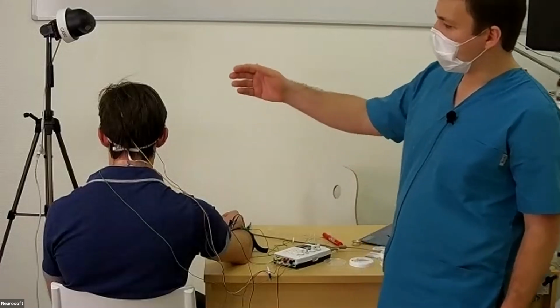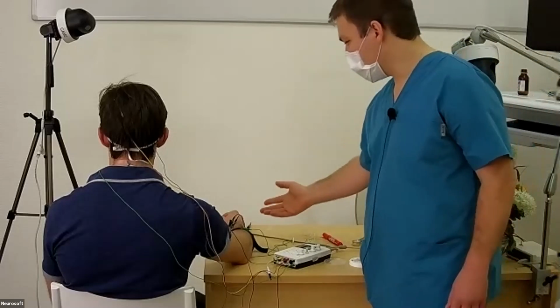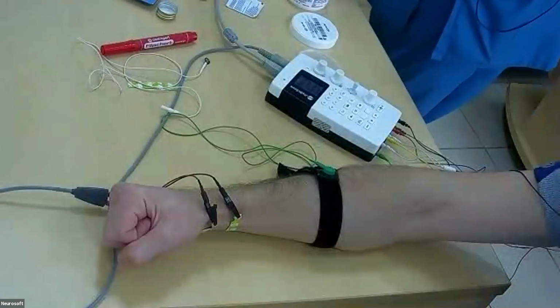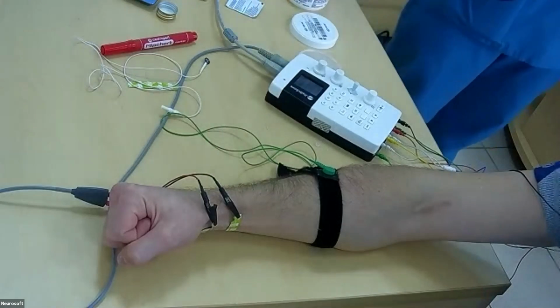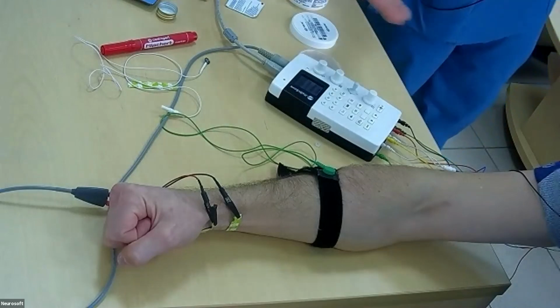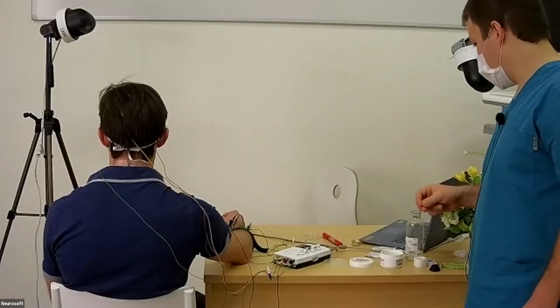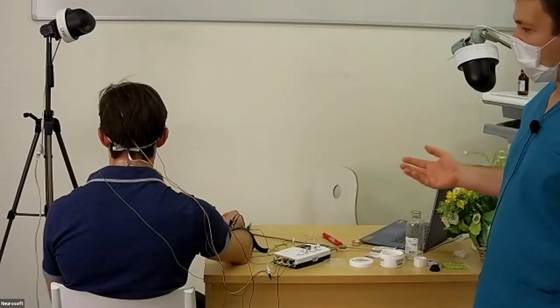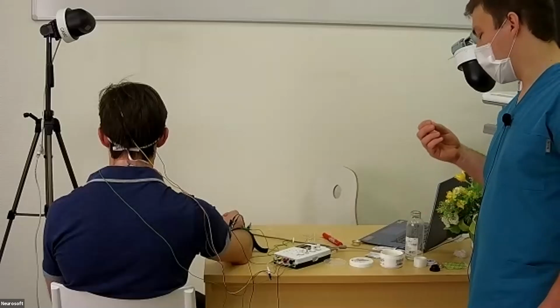We will register responses from these three lines from electrical stimulation, with median nerve stimulation. For registration we usually need to use cup electrodes, because we need very good, very low impedance.